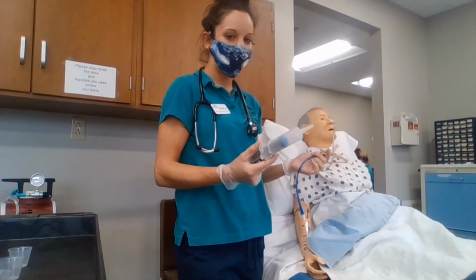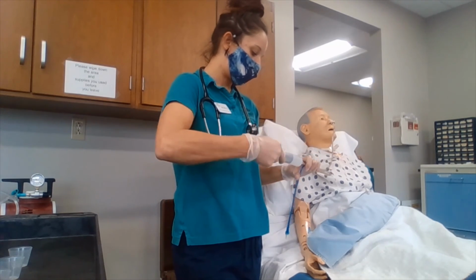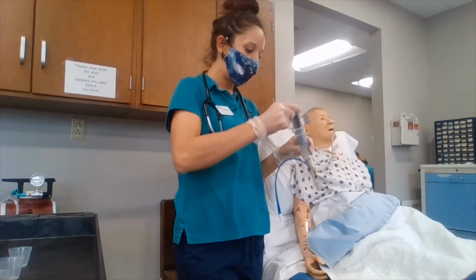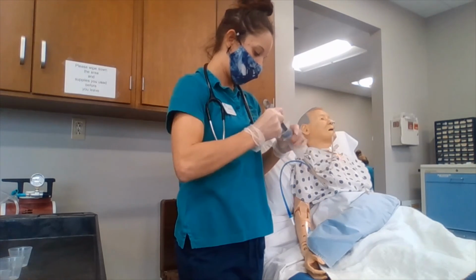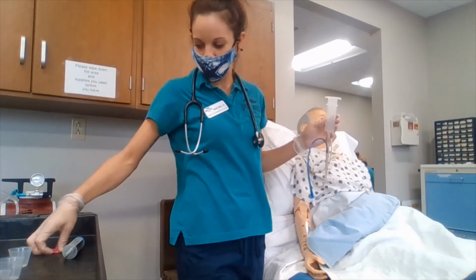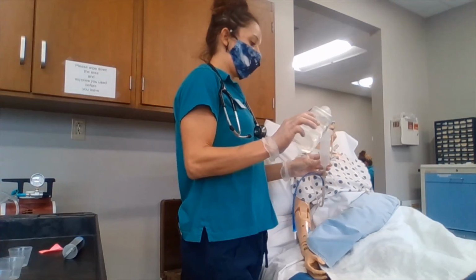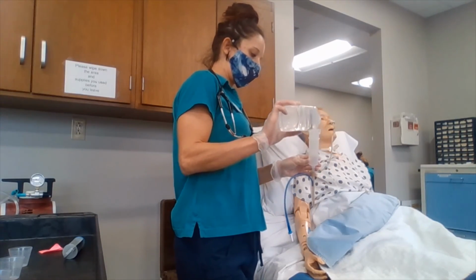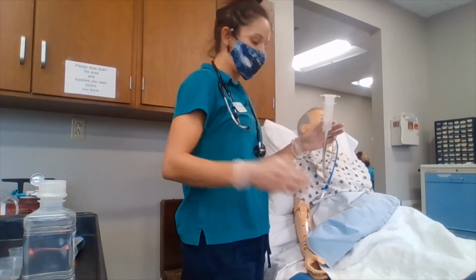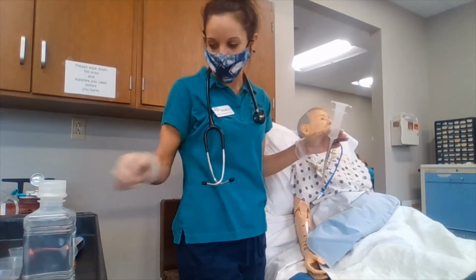So the first thing we're going to do is we are going to insert the syringe. We're going to make sure we have the proper and correct size syringe. We're going to be taking off the plunger to the top of it here. We are going to be putting 20 to 30 milliliters of water. After we're done flushing, we are going to then start giving our medication.